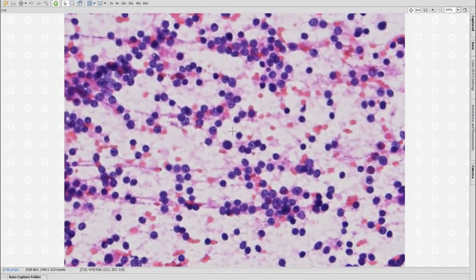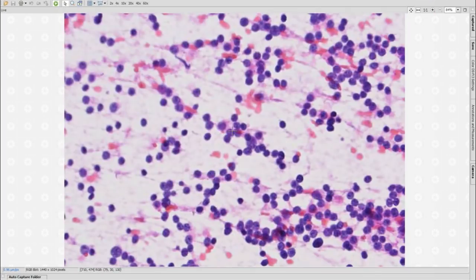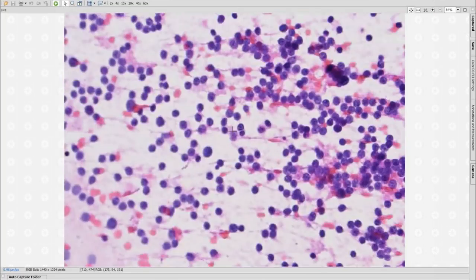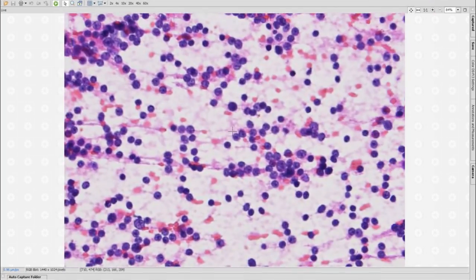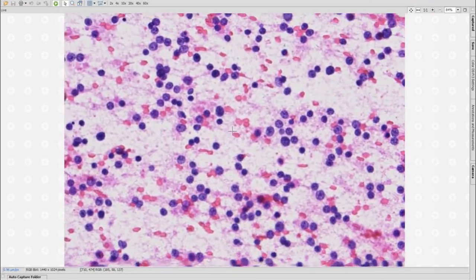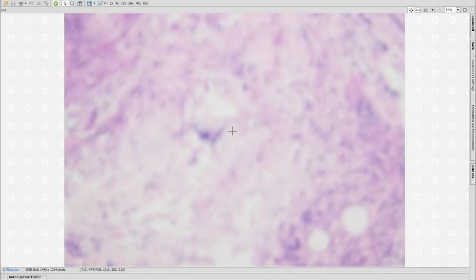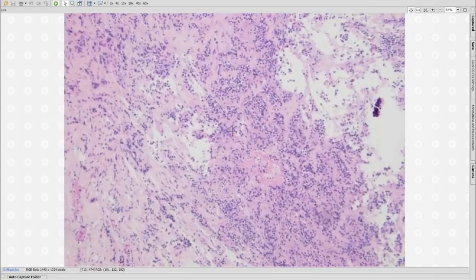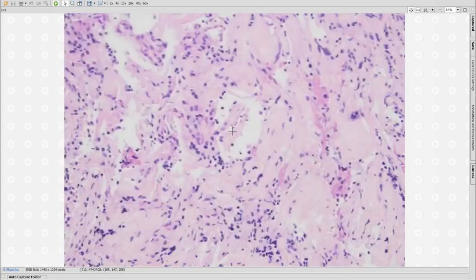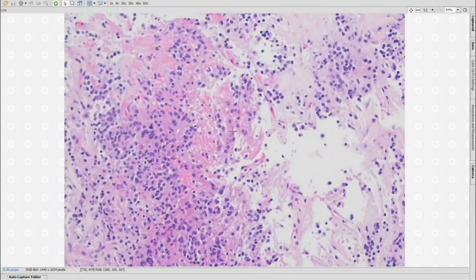Round. Spreading a bit better than a normal pituitary. And this is the corresponding frozen section control. This is a permanent slide. So this one could be tricky if you don't. The history is very helpful there.